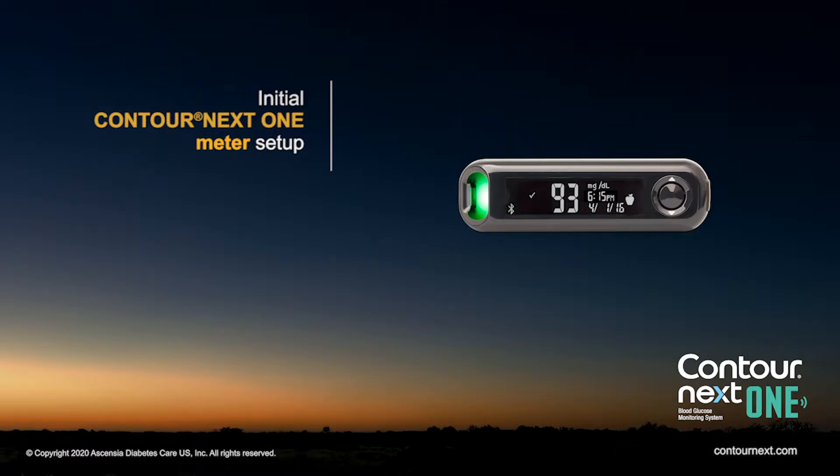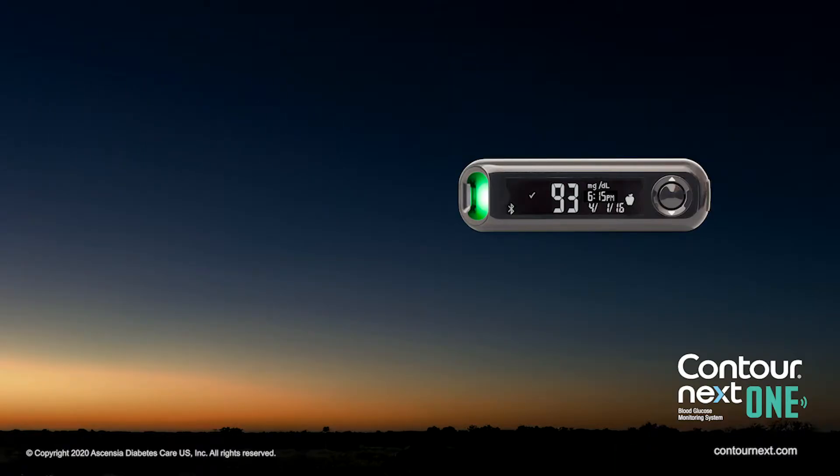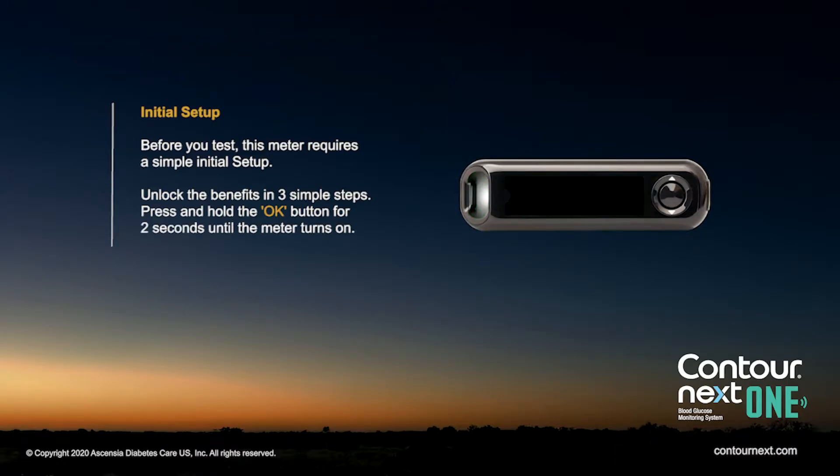Initial Contour Next One Meter Setup. Before you test, this meter requires a simple initial setup. Unlock the benefits in three simple steps. Press and hold the OK button for two seconds until the meter turns on.